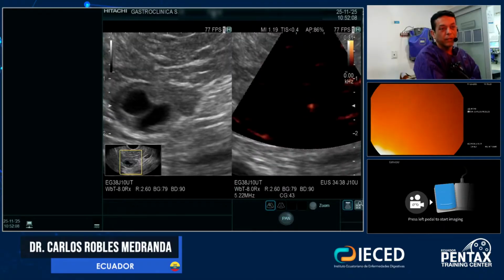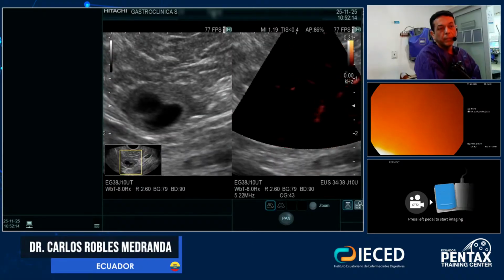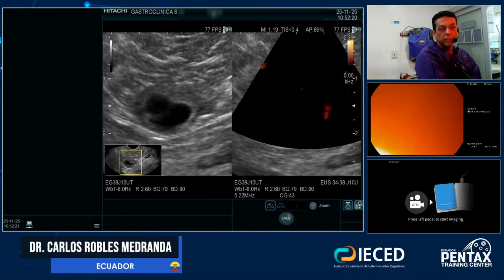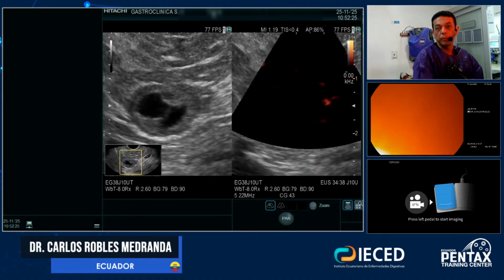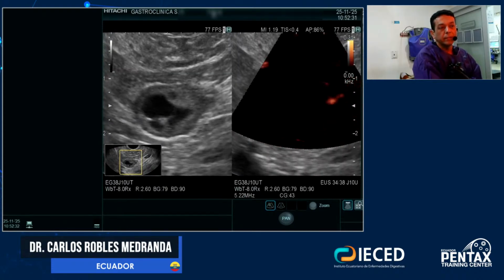Coincidentally, a few days ago I had to give a small lecture about this, and today I wanted to show you a little bit how I evaluate these lesions. I believe this is one of the biggest challenge lesions that we need to evaluate when we are doing EUS.